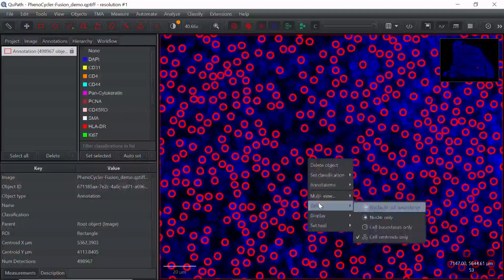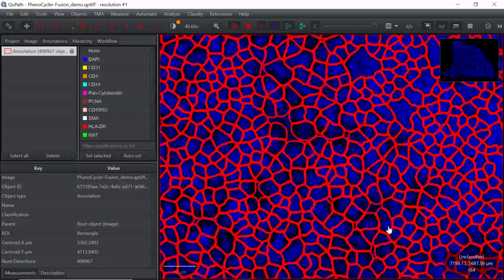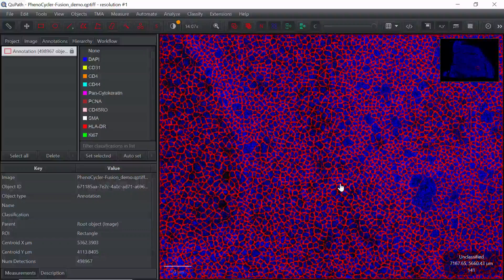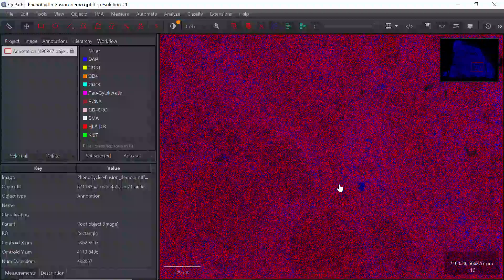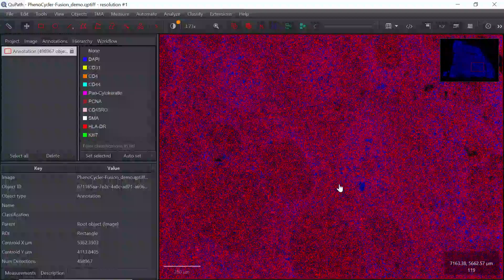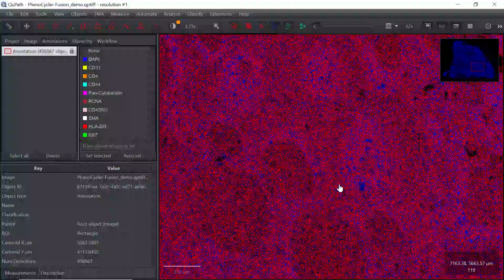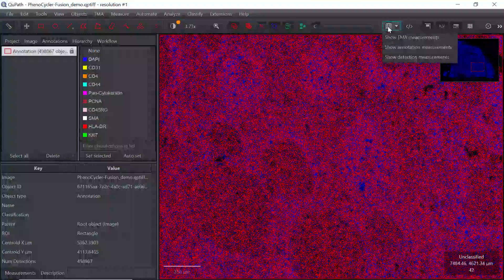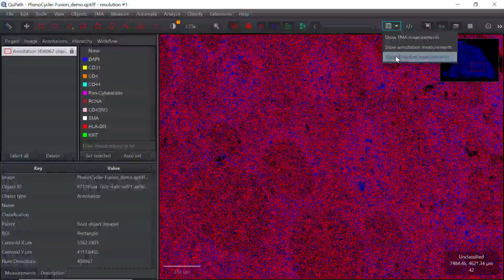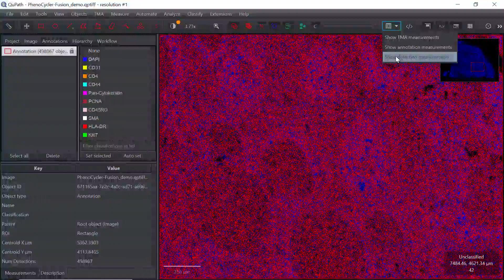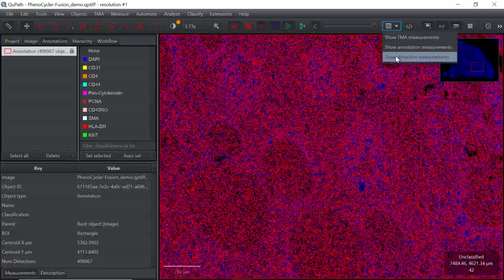Let's switch back to the cell boundaries only view since it looks cleaner. QPath has detected all the cells in this dataset. Now we can get the cell information. Clicking this button lets us select the cell detection measurement.